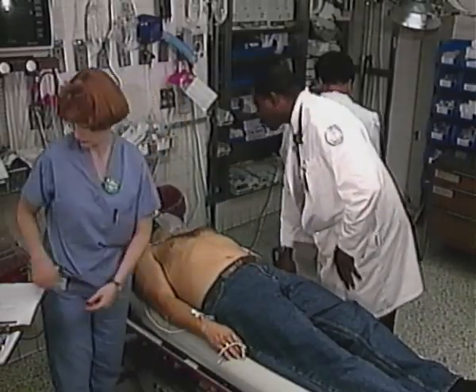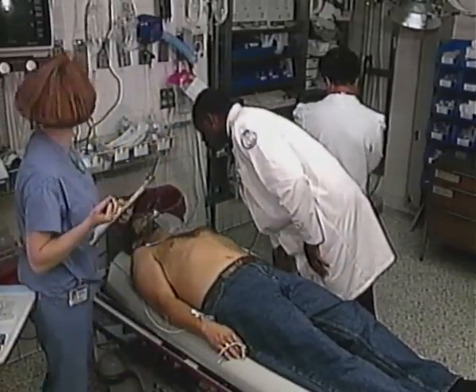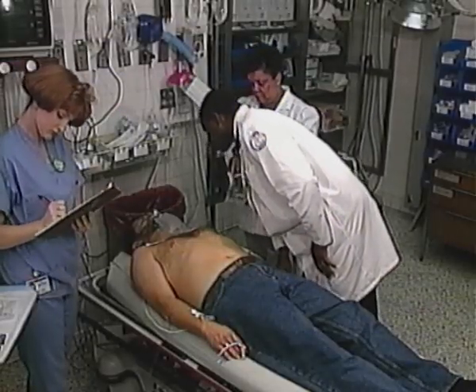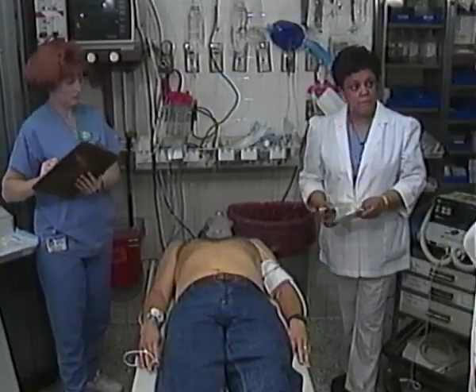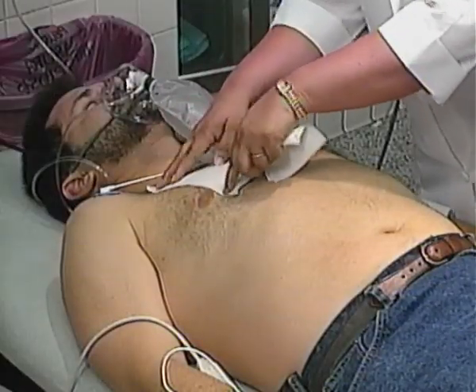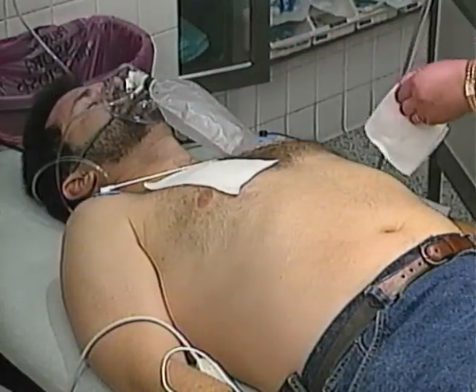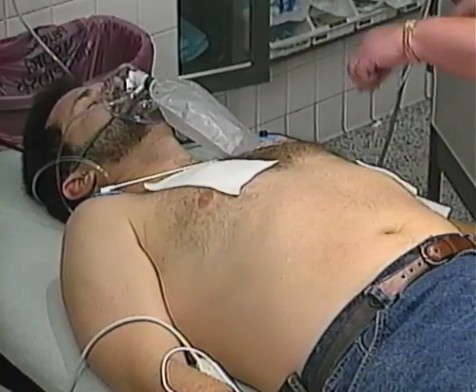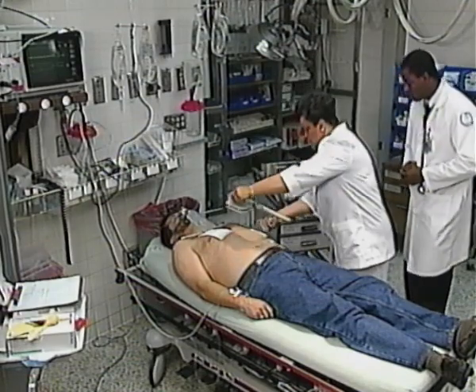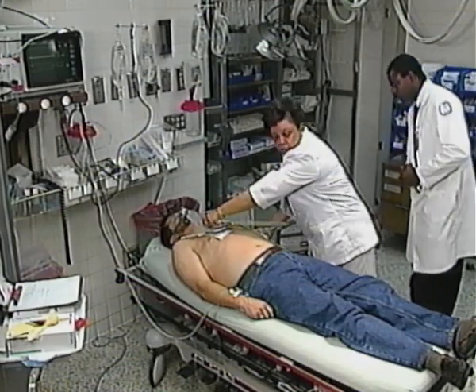Mr. Jackson, can you hear me? Mr. Jackson, we're going to try and slow down your heart. It's beating too fast, okay? Would you like for me to sedate him first? No, he's barely with it, and his blood pressure is too low. Stand clear, shocking. All clear, shocking.